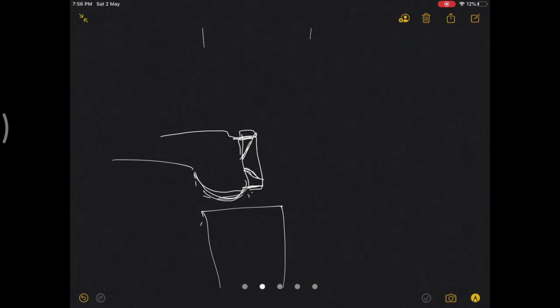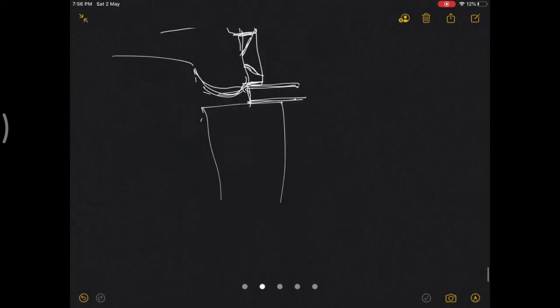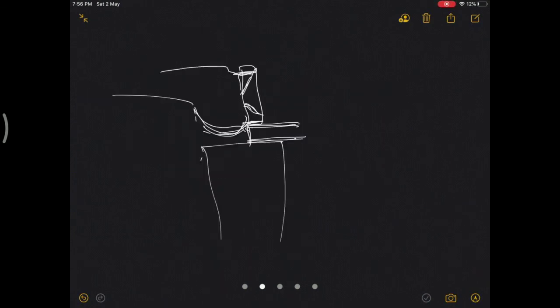So what they do is, they put a spacer block here at 90-degree flexion, and they check whether the anticipated cut will balance the flexion gap or not. Then here comes something called a negative block.